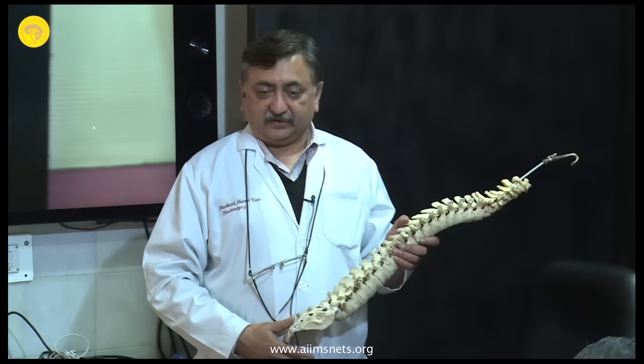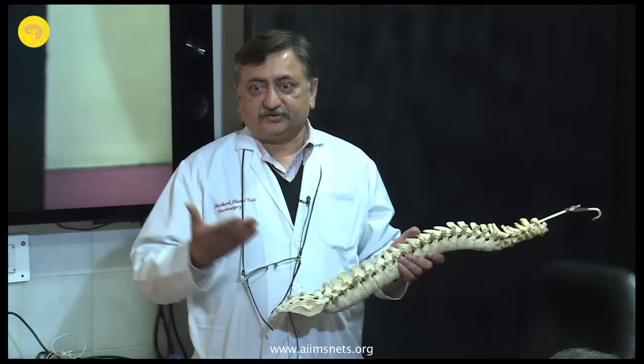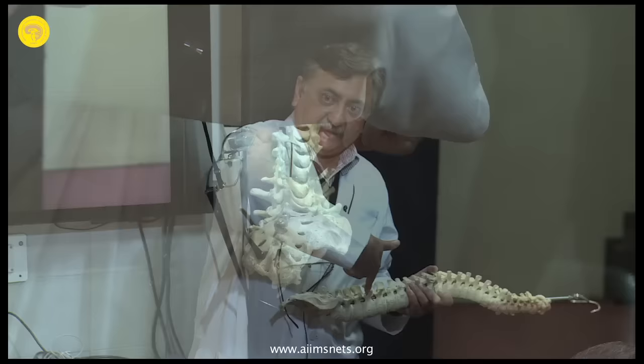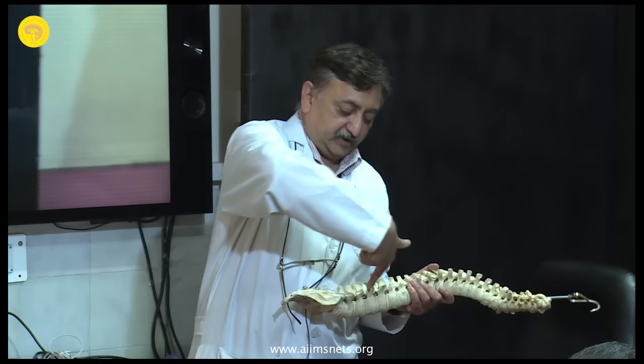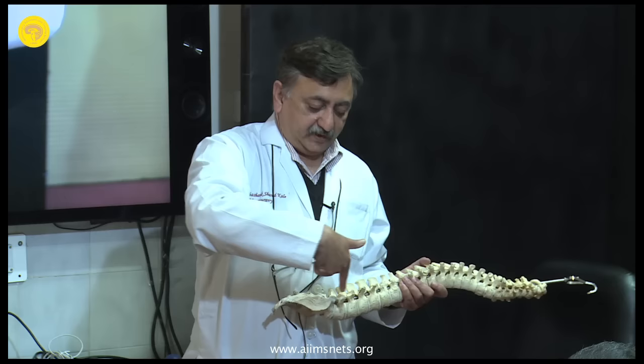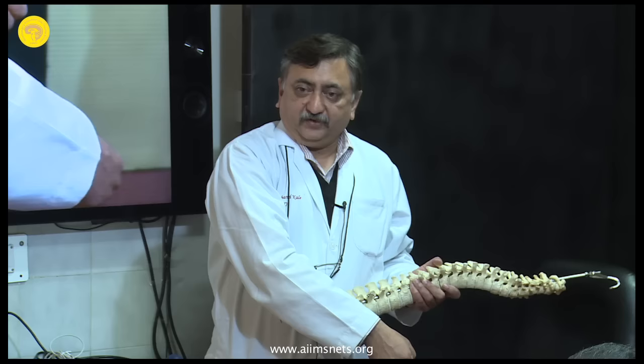After you use the awl, then you use a pedicle finder. There are different names, but I prefer to call it a pedicle finder. It's blunt from the front. Sometimes it's angled medial, but I use a straight one. With the pedicle finder, you can keep it first vertically, then you can give it your medial angulation, and then you can give it the superior or inferior angulation the way you want it to be. Because if you are at L5S1, you need to go downwards. Generally for the superior lumbar vertebra, it's straight down. So with the pedicle finder, if you are in the cancellous bone, you will be able to do it with your hand. You just feel it and put it in.